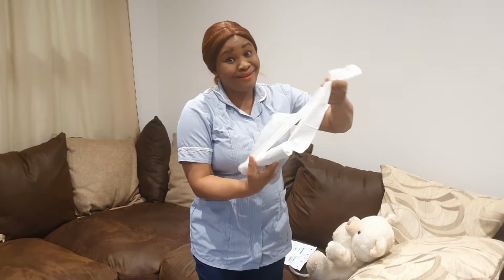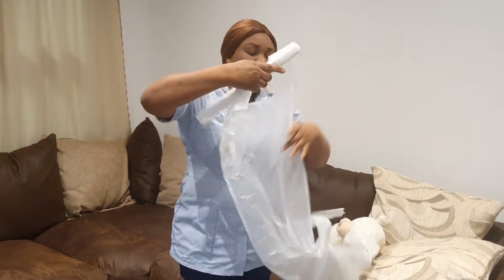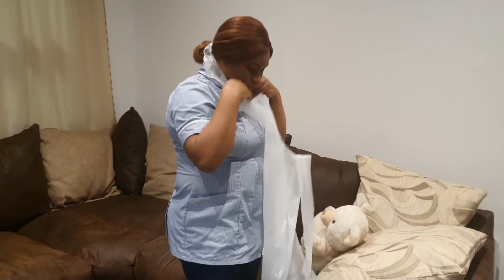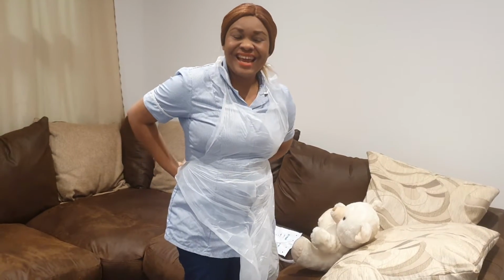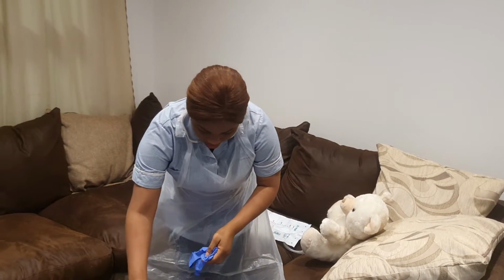All right, guys. Really simple, guys. Trust me. OSCE is so simple. You're definitely smashing your OSCE. All right, so I put on my apron now. I'll put on my gloves and off I go to my patient. So come with me, guys, and let's do catheter sample of urine now.